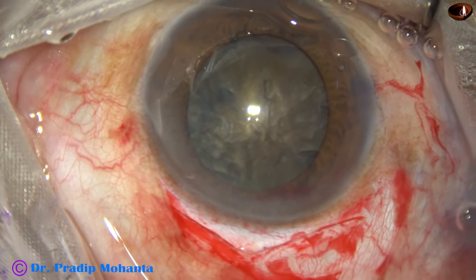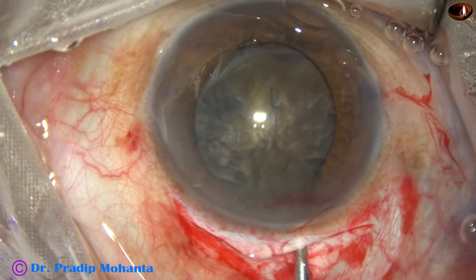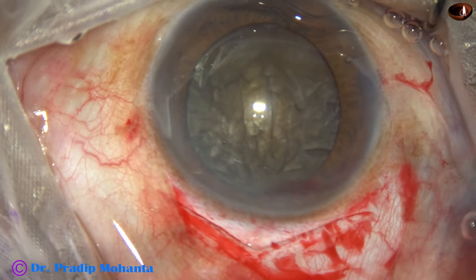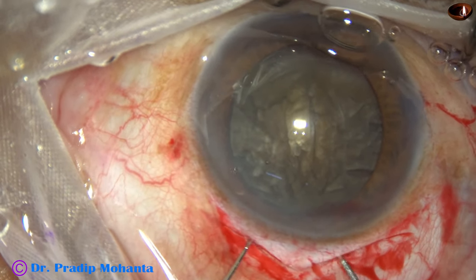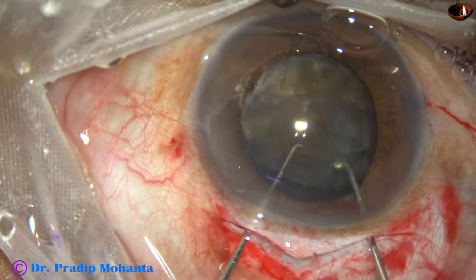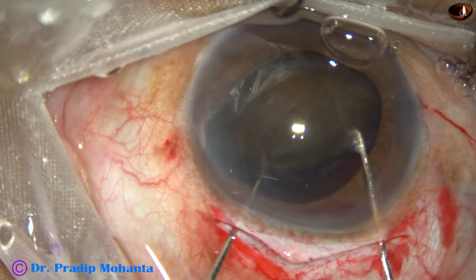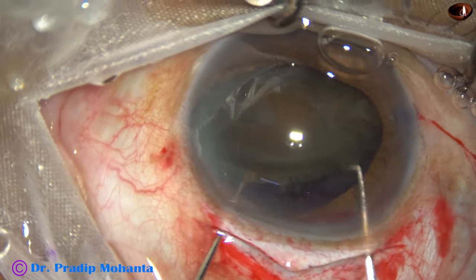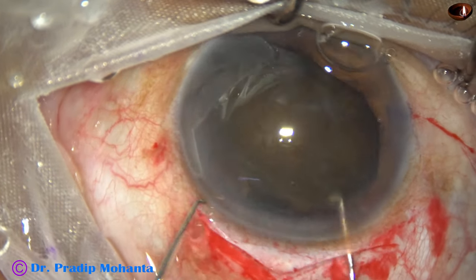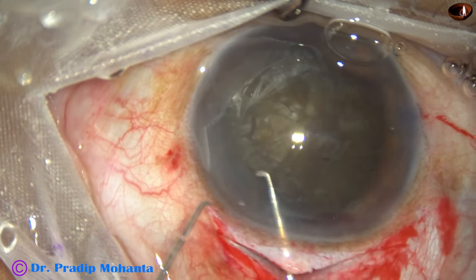We inject viscoelastic and take two Szynski hooks to prolapse the nucleus. First, we rotate it, then prolapse one side of the equator. One hook goes behind, the other rotates and dials the nucleus, and the nucleus comes into the anterior chamber.